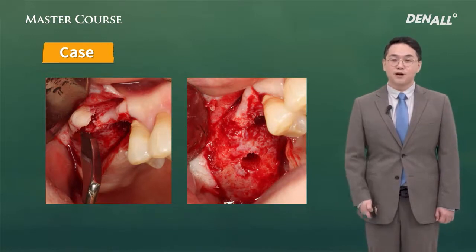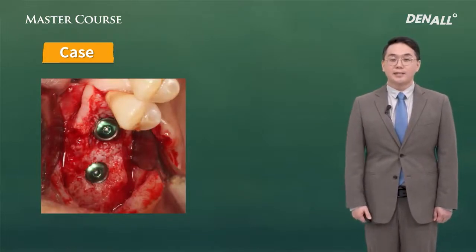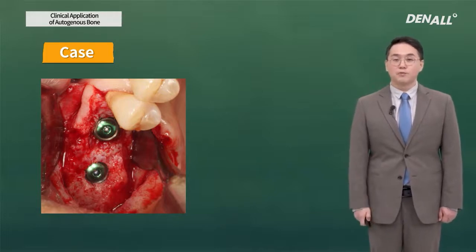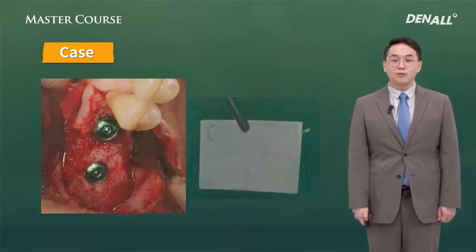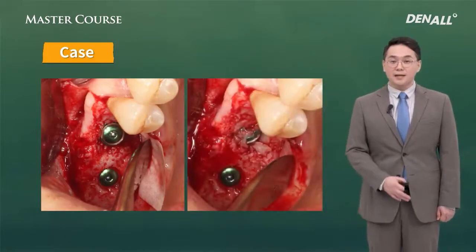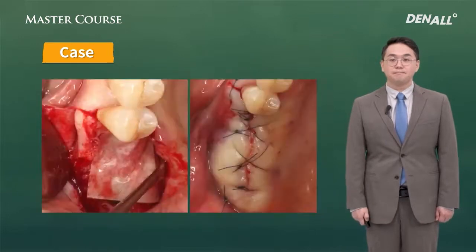After the preparation, 2 implants were placed at 16 and 17. As we expected on the CT, the palatal side of the number 16 implant showed the bone defect. The palatal side is exposed. We decided to do GBR using membrane and bone graft material. The membrane is positioned, and below the membrane, on the palatal bone defect, the harvested autogenous bone particulates are put.